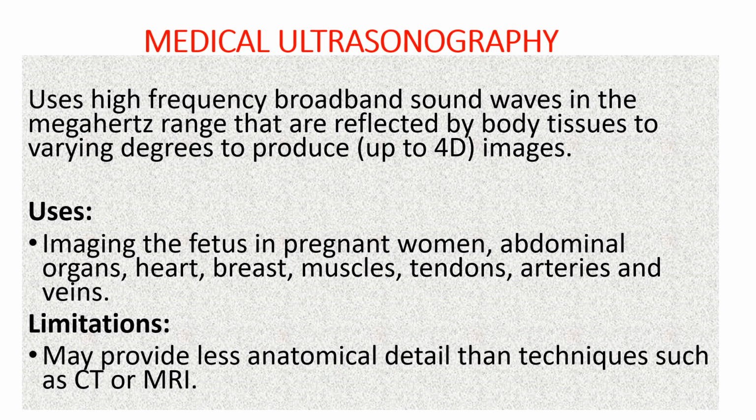And medical ultrasonography. This modality is well known to most people. I'm sure some of us may have had cause to go through ultrasound in one way or the other. It uses high-frequency broadband sound waves in the megahertz range that are reflected by body tissues to varying degrees to produce images. It can be used in imaging the fetus in pregnant women, abdominal organs, heart, breast, muscles, tendons, arteries, and veins, and so on. One major limitation of ultrasonography is that it provides less anatomical detail when compared to techniques like CT or MRI.